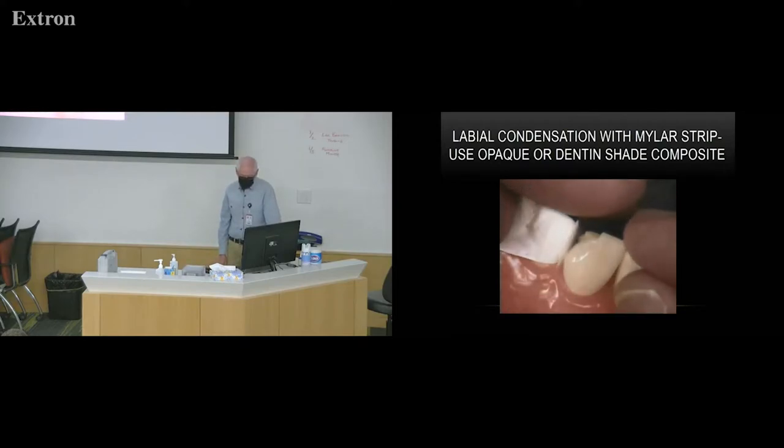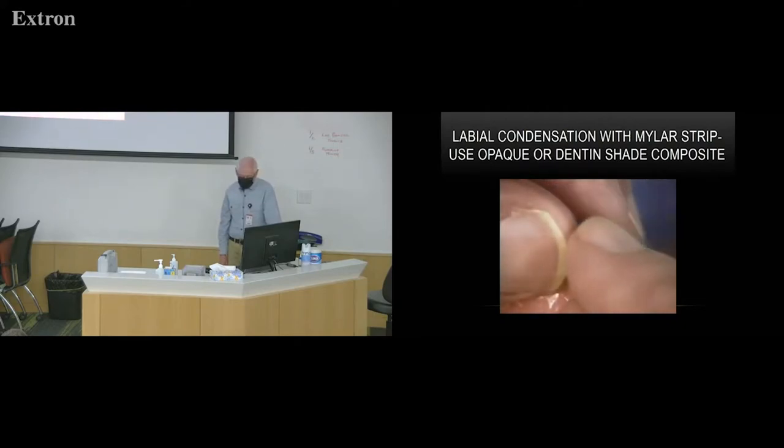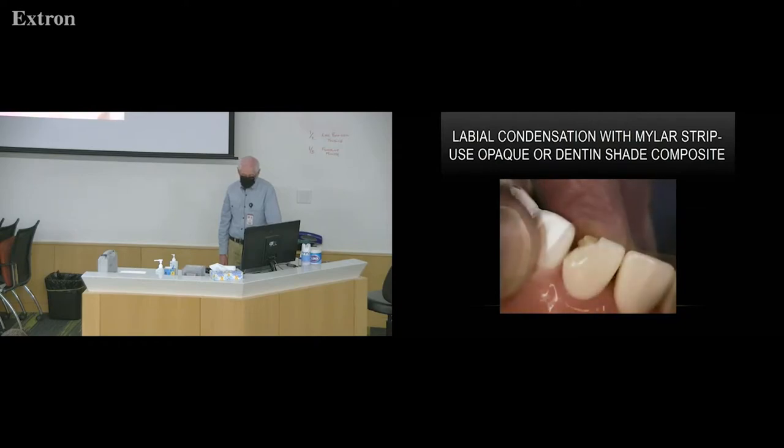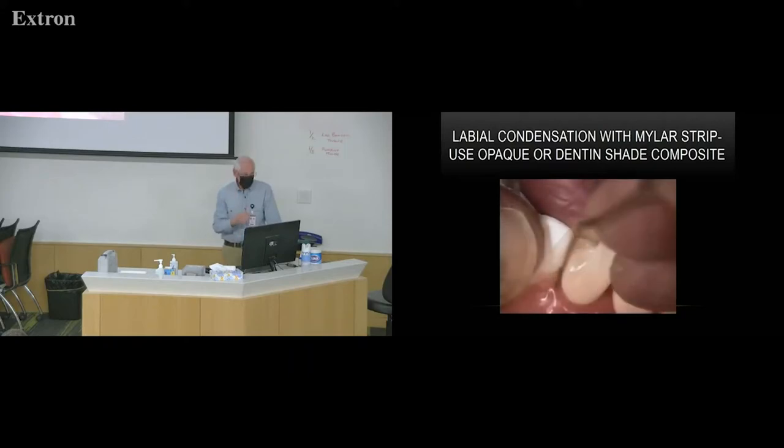Putting the matrix in. And then your finger goes up against the lingual. So now you can add more composite and your finger's backing up that matrix. Now I'm not trying to fill the whole tooth. We're going to do this in three increments. The first increment is the lingual increment, and that's what we're doing right now.